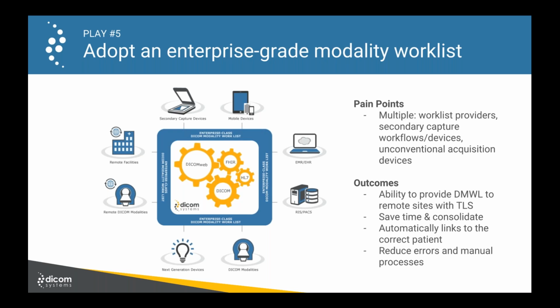And so most worklists are designed so that once you mark an exam as complete in the modality, it drops off that list. And so what happens is the next day or 2 days later, a new object is created, whether it's a secondary capture or a 3D object, or perhaps images, visible light image, video, maybe it's an endoscopy study on a Stryker device or an Olympus camera.